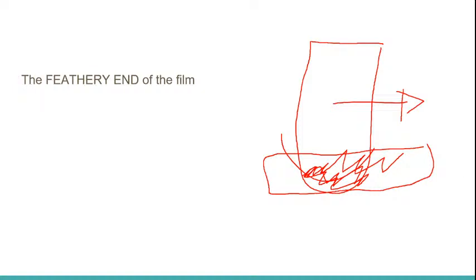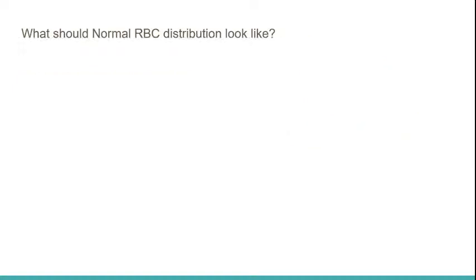All right? Now, let's move on to distribution. What's the normal distribution of RBC like? So what's the normal distribution of RBCs?